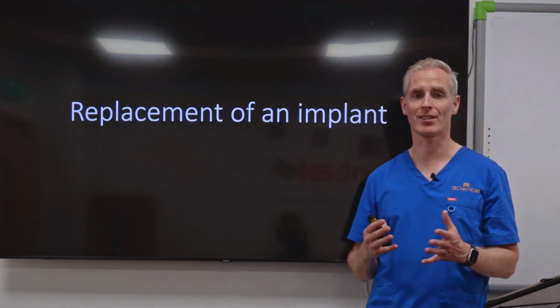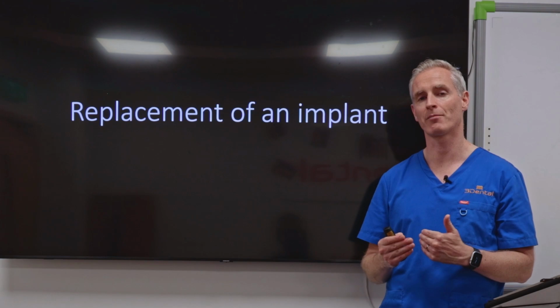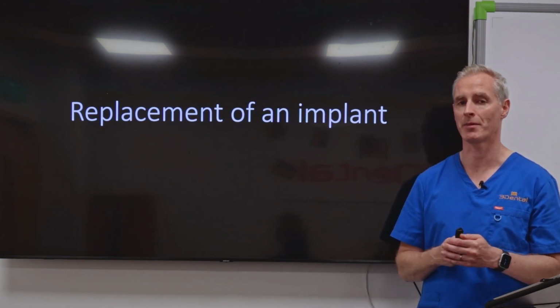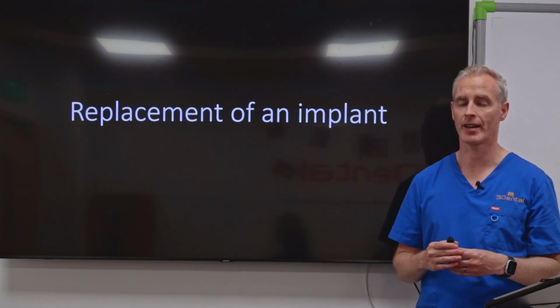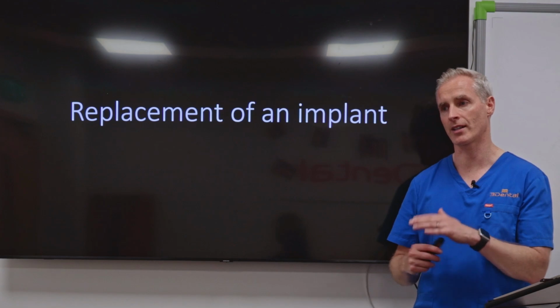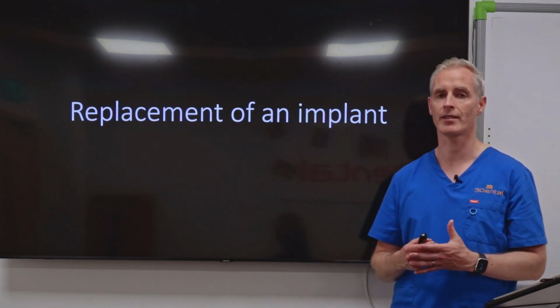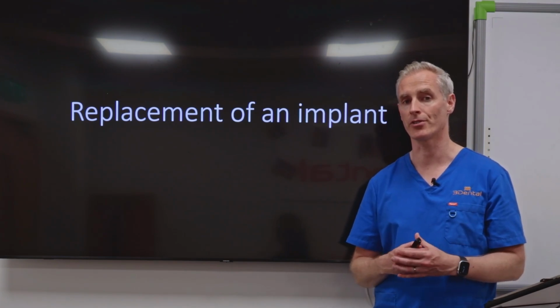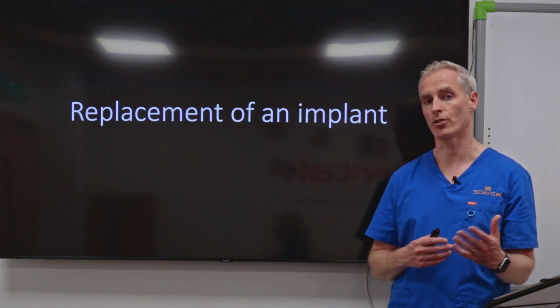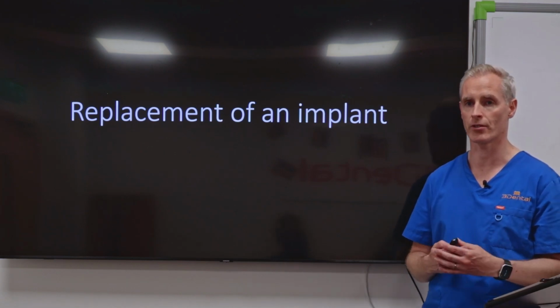And this particular case is quite an interesting one. It is a single implant at the front of the mouth, but it's interesting because this patient came to me with an implant that had been placed at a different clinic. It was a clinic that was abroad for dentistry. He came to me expecting me to be able to put a tooth on top of that implant, but unfortunately when I assessed his case I found out that the implant was not in a great position and the treatment couldn't be done. So we had to do some remedial work first before we could actually get him his tooth.